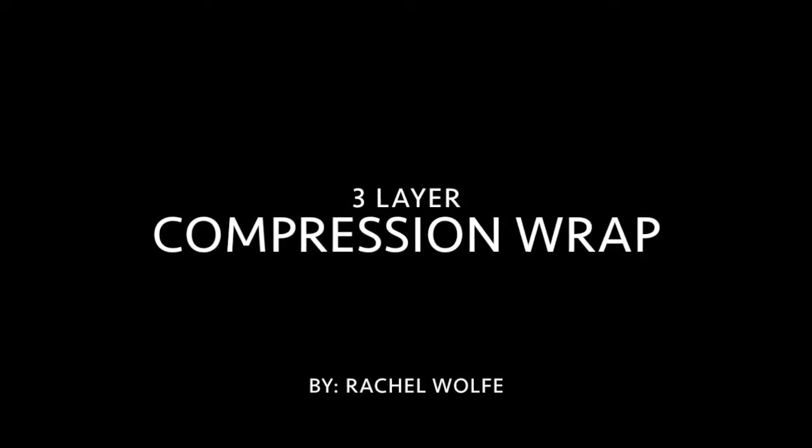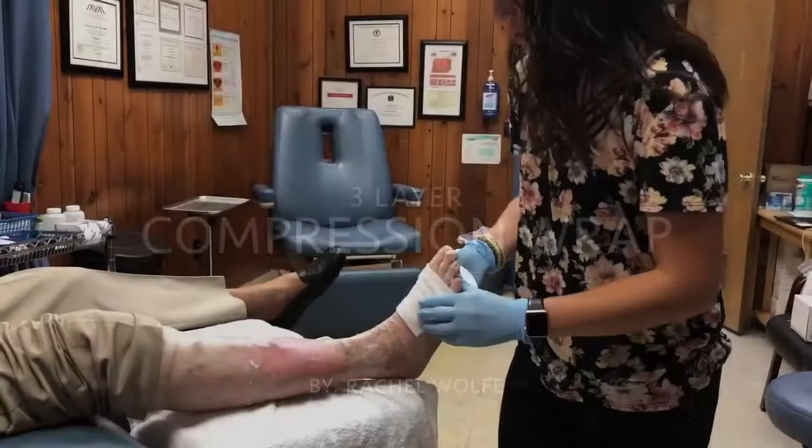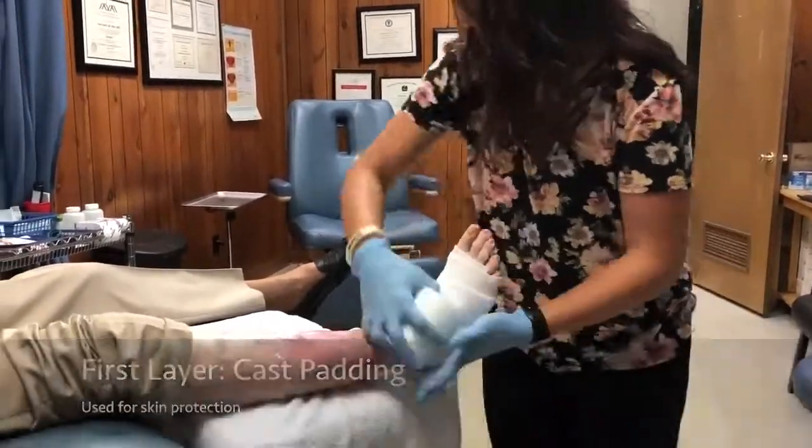Today I will be applying a three-layer compression wrap to aid with wound closure. This first layer is known as cast padding, which is used just for protection of the skin.